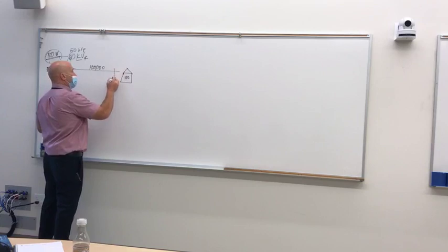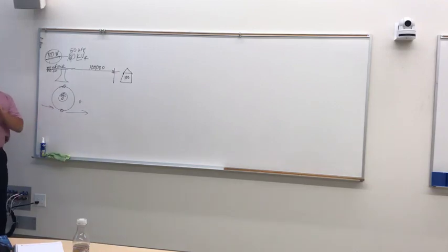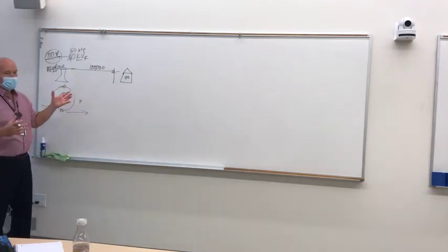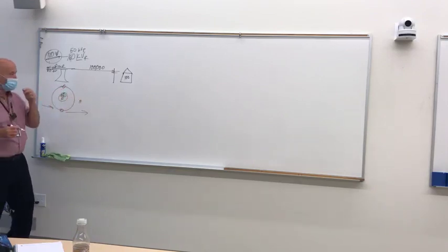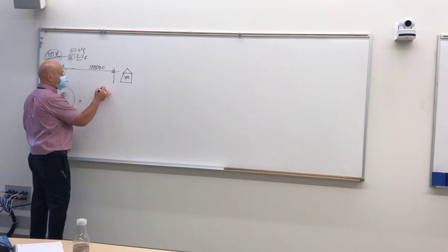So we've got a telephone pole out here, and on top of the telephone pole we've got a transformer. Inside that transformer are two coils of wire. There's some other stuff in there as well, but primarily what makes the transformer a transformer is it's got two coils of wire. So the coils are like this.